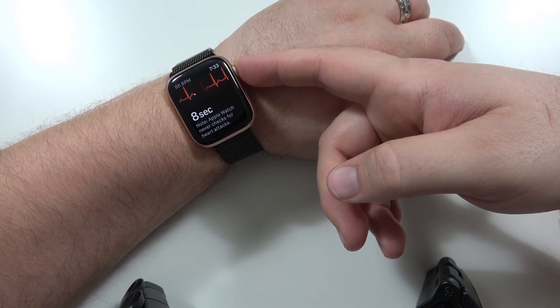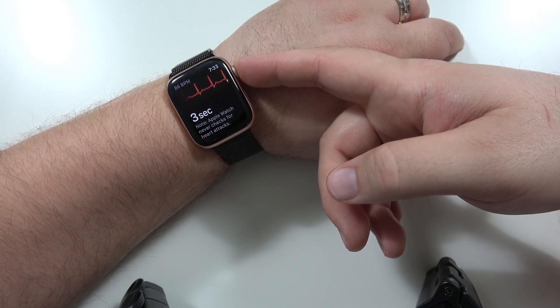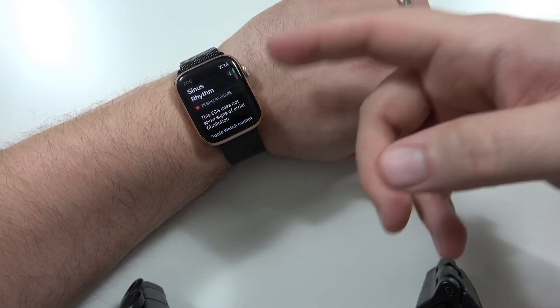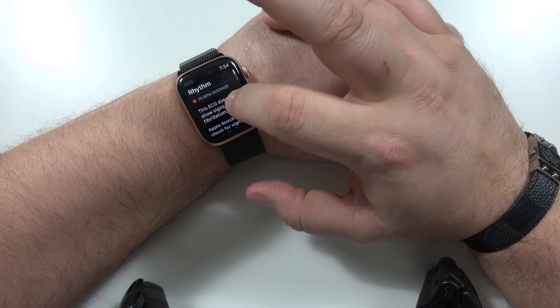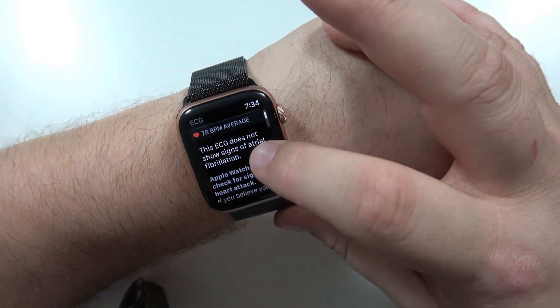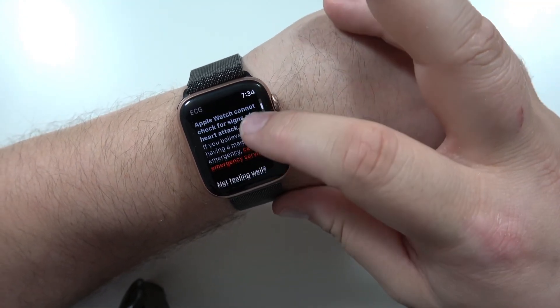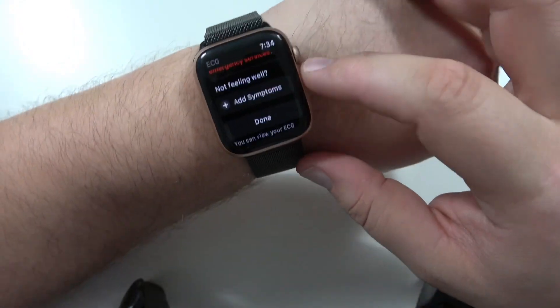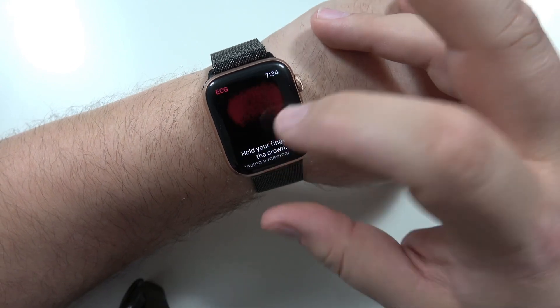It's giving me a countdown so I know how much longer I have to go, which is pretty sweet. Sinus rhythm. My beats per minute: 78. This ECG does not show signs of atrial fibrillation. Apple Watch cannot check for signs of a heart attack. If you're not feeling well, you can add symptoms, or if you're done, you can just hit done.